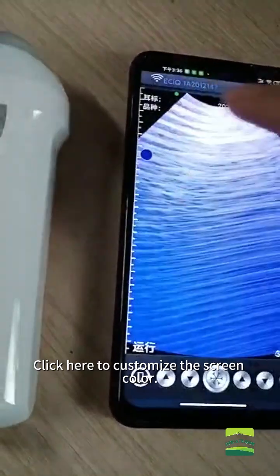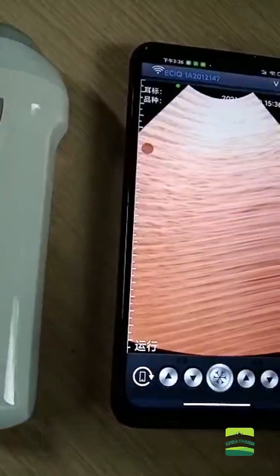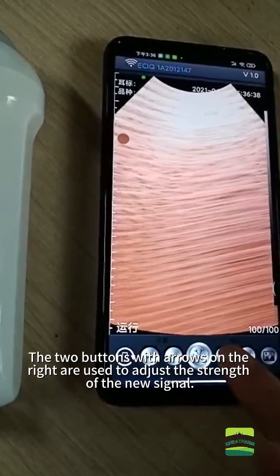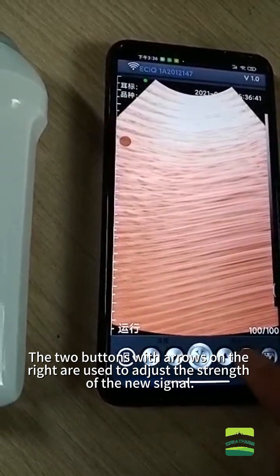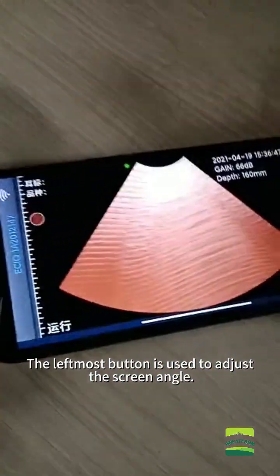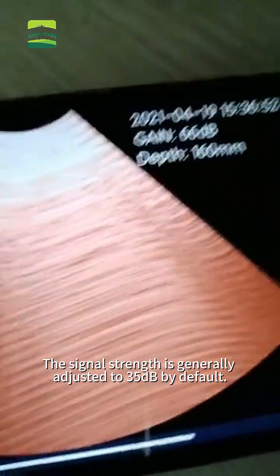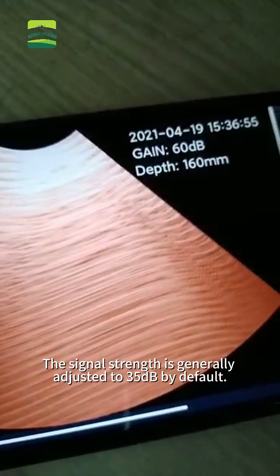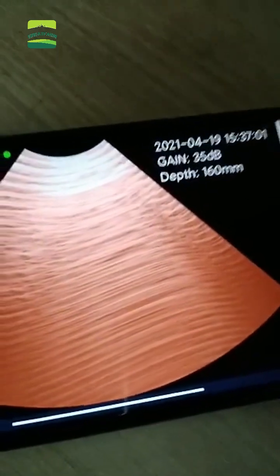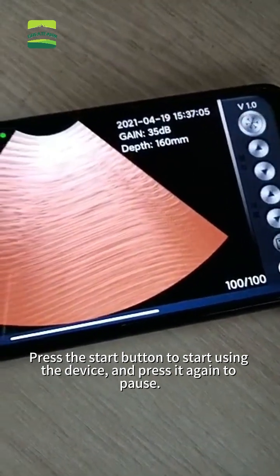Click the middle button to start using the device. Click here to customize the screen color. The two buttons with arrows on the left are used to adjust the depth. The two buttons with arrows on the right are used to adjust the strength of the signal. The leftmost button is used to adjust the screen angle. The signal strength is generally adjusted to 35 dB by default.